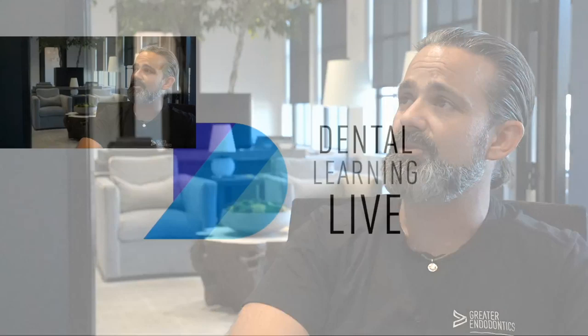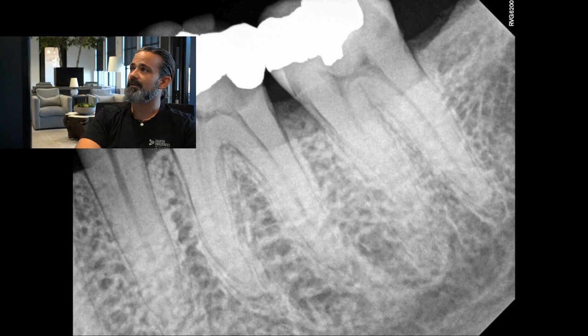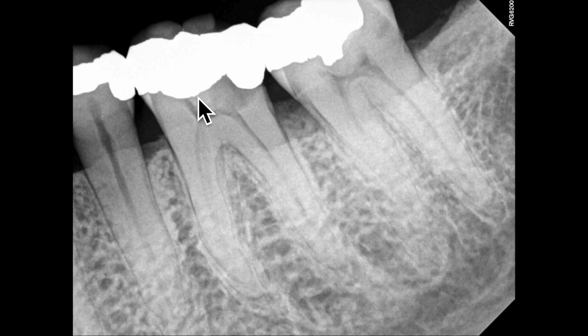We're going to do a lower molar — tooth number 19. This one is caries-induced pulpitis with an aging amalgam restoration. Let's pull this x-ray up. We've got a pulp stone, we have a pulpal floor, we have an amalgam, and underneath that is a whole bunch of decay. Part of the wall broke out on it.